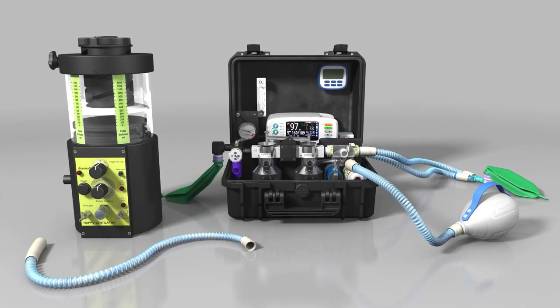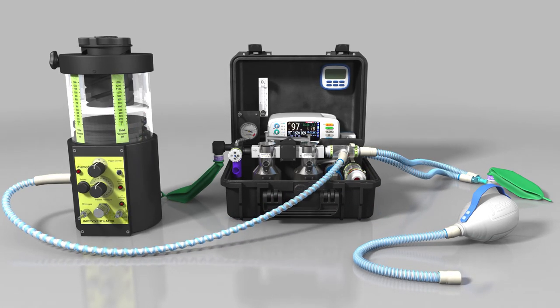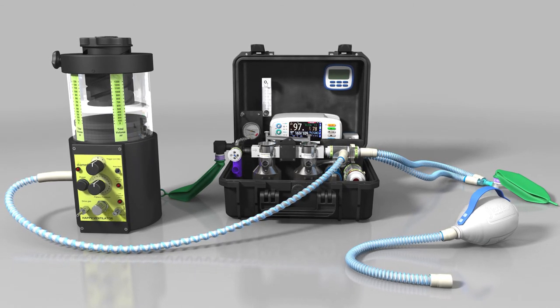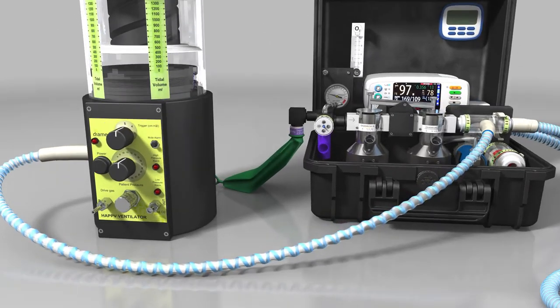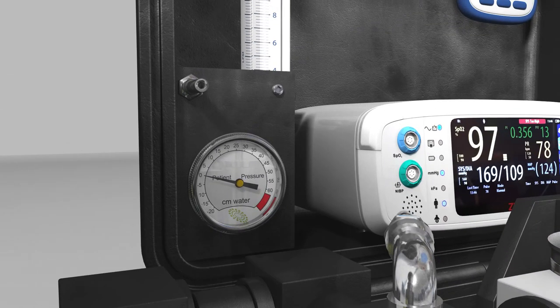If the DPA Duo is being used in conjunction with the HAPPV Ventilator, the circuit block is removed and the ventilator outlet is simply connected to the DPA inspiratory valve in place of the self-inflating bag. To set the initial patient pressure, run the ventilator while occluding the patient valve outlet. Adjust the pressure control until the desired pressure on the gauge is shown.